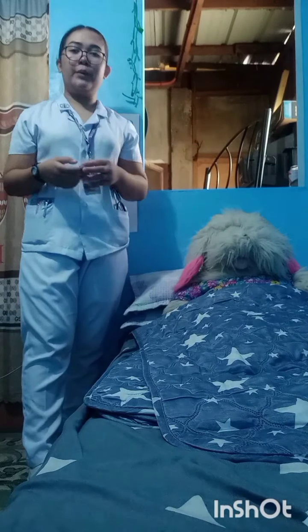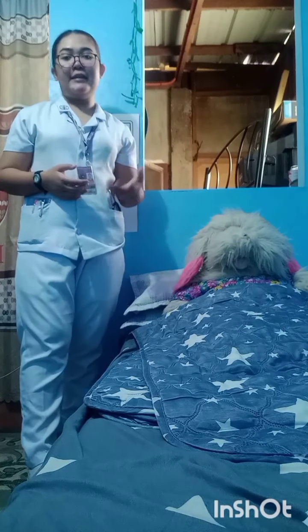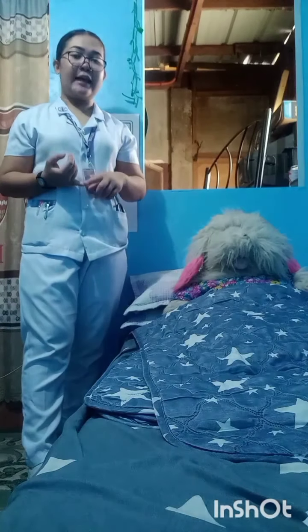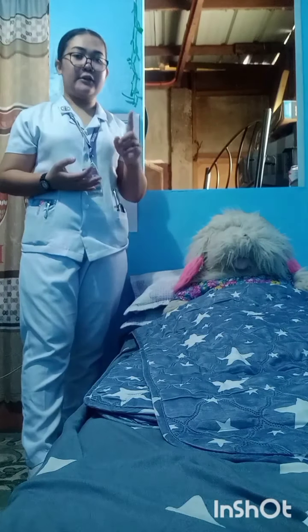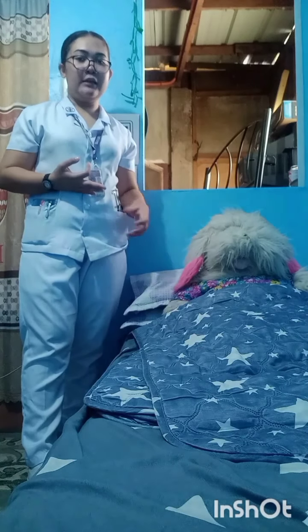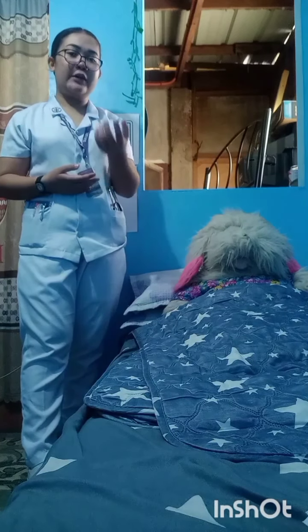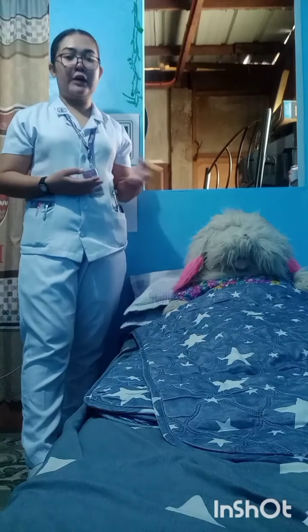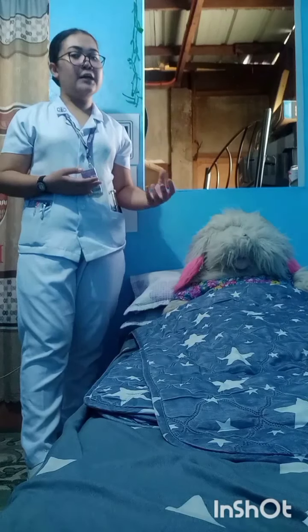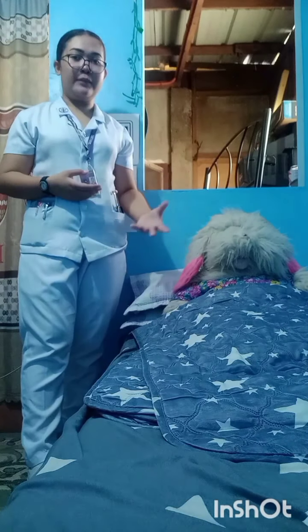Prior to performing the procedure, introduce yourself and verify your client's identity using the agency protocol. It is to ensure that you have the right client, right patient, to administer the therapy that the doctor ordered. Also, introducing yourself can create rapport with the patient and assurance that you are the nurse or the assigned student nurse who will help them.